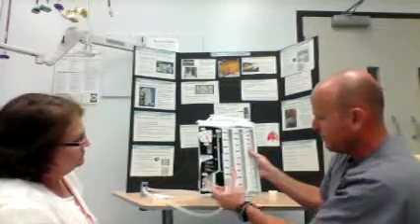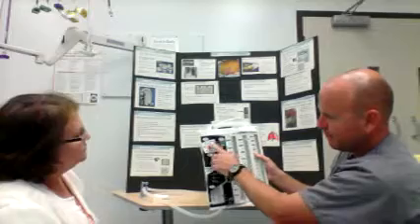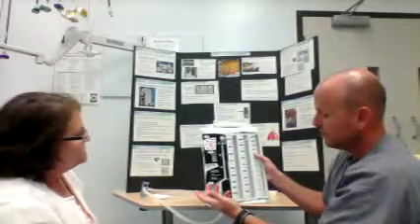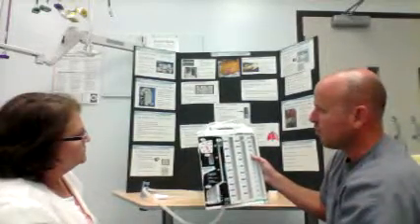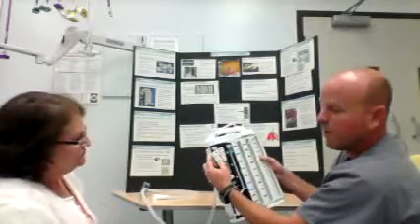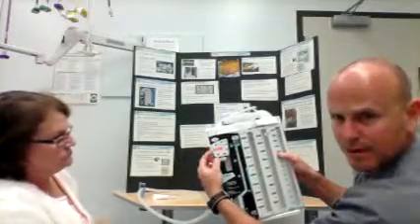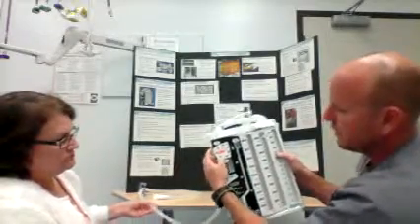Okay? Just to get to know your parts here, this is the centimeter of water pressure that the surgeon will tell you what to set it on. Normally it's minus 20 centimeters of water, but there is a dial on the side. So if the doctor says, I wanted it negative 30, then you just move the dial. And you can see there, and the dial just goes up, and you can set it to whatever pressure you want.